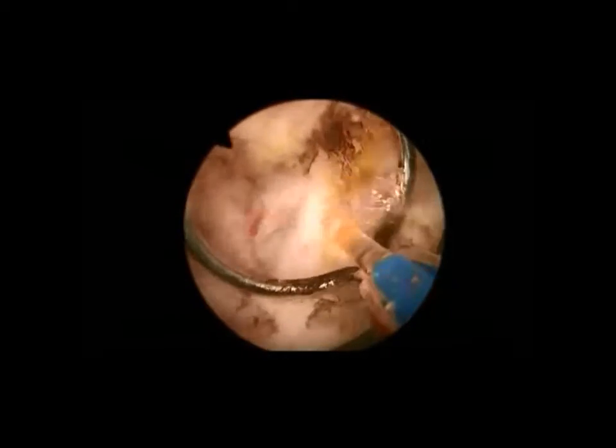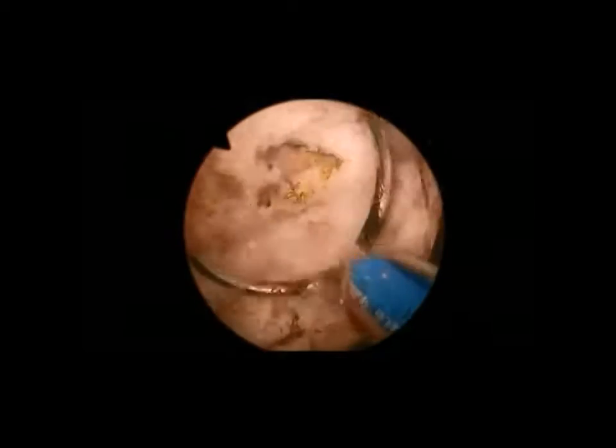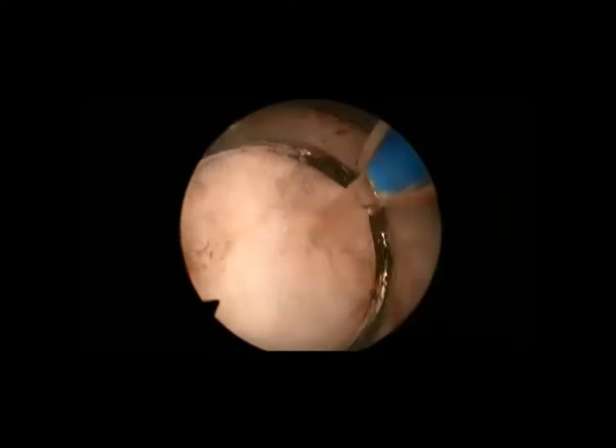expanding that space between capsule and adenoma, working both medially and then counterclockwise up toward the lateral aspect of the adenoma, continuing to work retrograde somewhat to roll up the apex, and then working further counterclockwise up to the lateral and anterolateral aspects.